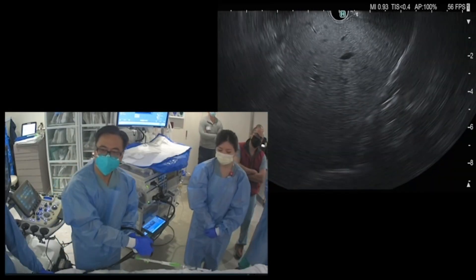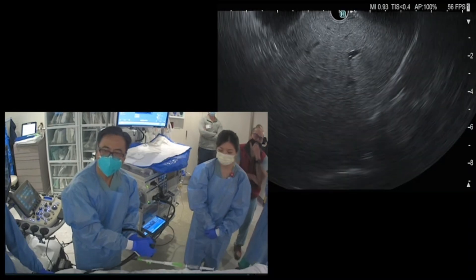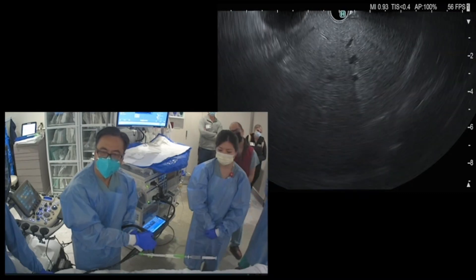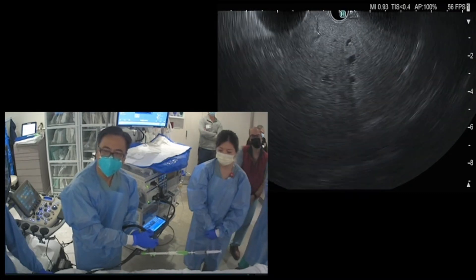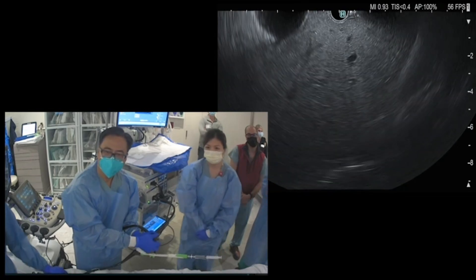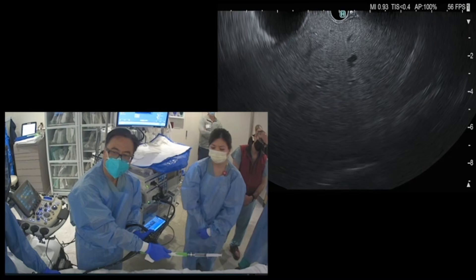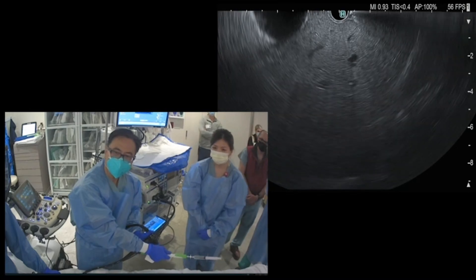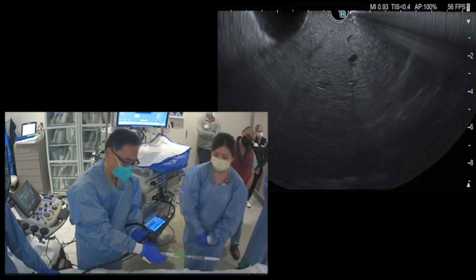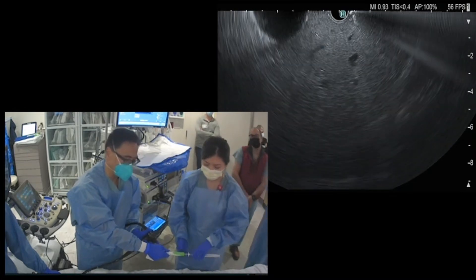We typically use a 3-actuation technique using a primed Francine tip FNB needle. For the initial throw, we ensure that the stopcock syringe is not attached to the needle. Not placing the stopcock syringe initially prevents any obstruction to flow of fluid that is displaced as the liver specimen is brought into the needle, pushing the fluid proximally closer to the handle.